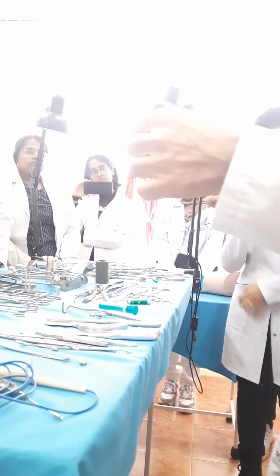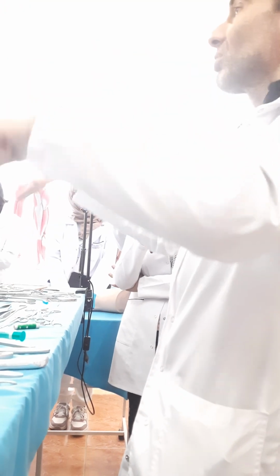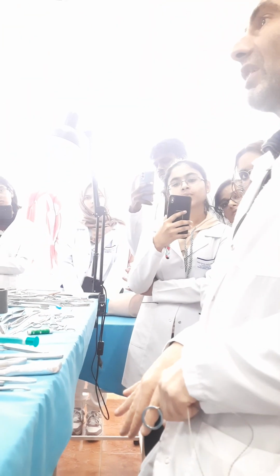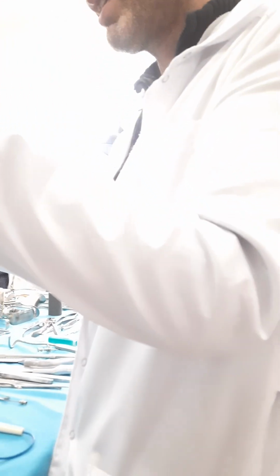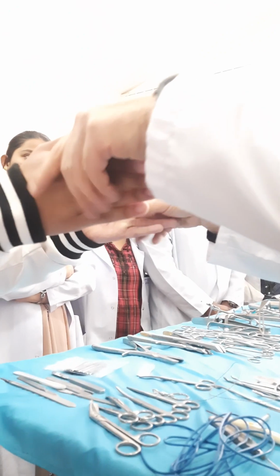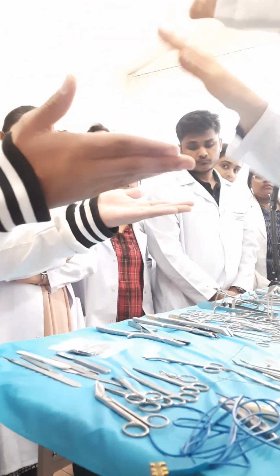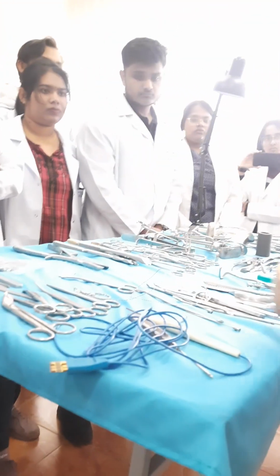By the way, cut the skull bone not straight but at 45 degrees, because afterwards you must replace the cap in its place. If it is cut straight, it will sink down. You understand or not? Hold your hands like this. If you cut that way, after you put the cap it will go down. If you cut at 45 degrees, it will sit in its place. Thank you very much. Let's continue.